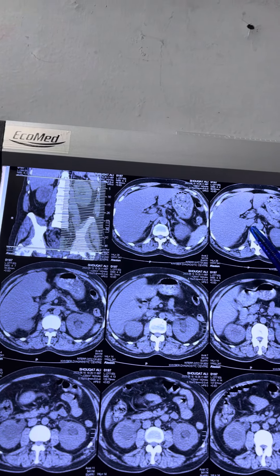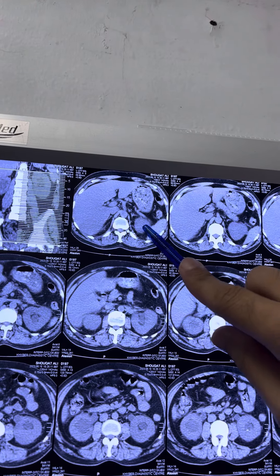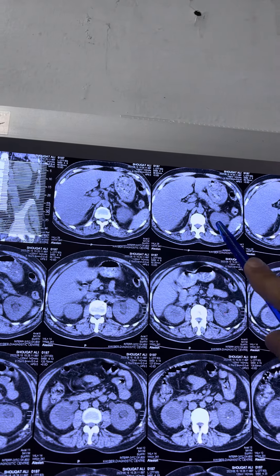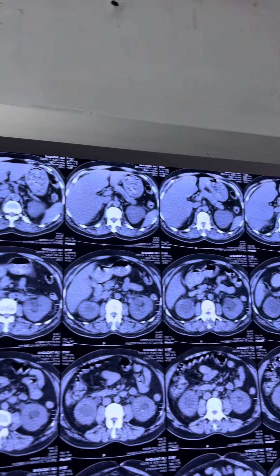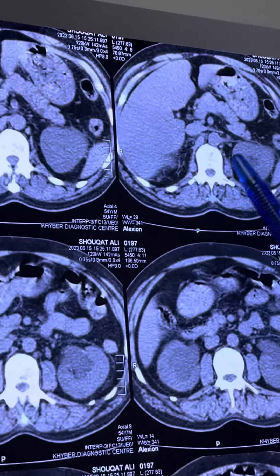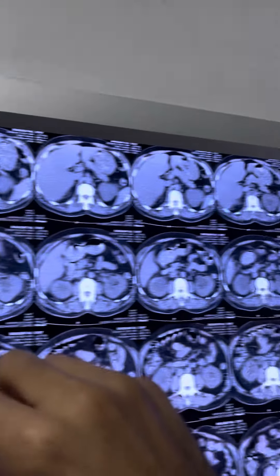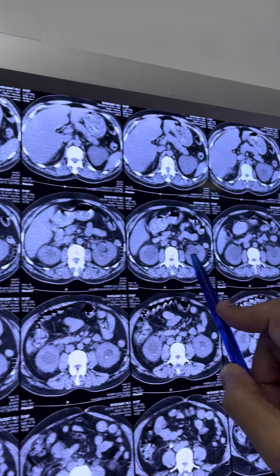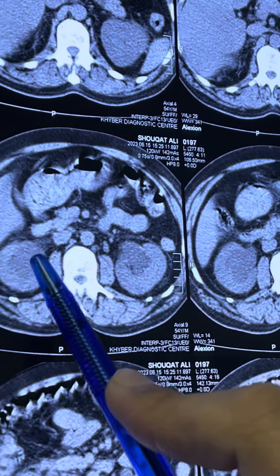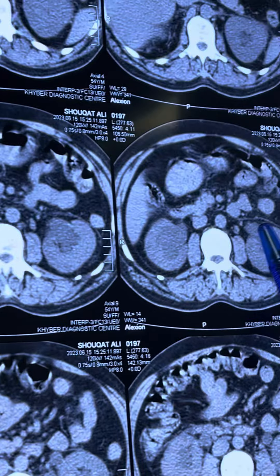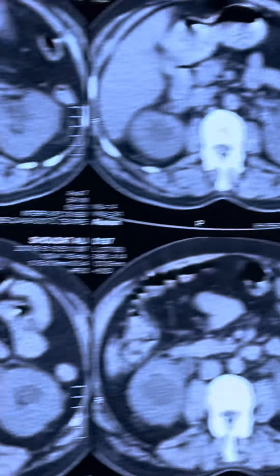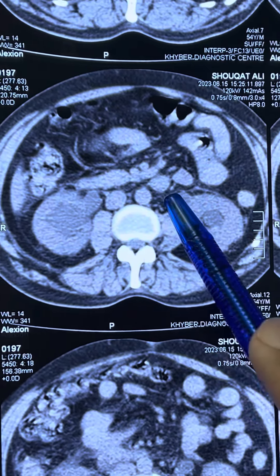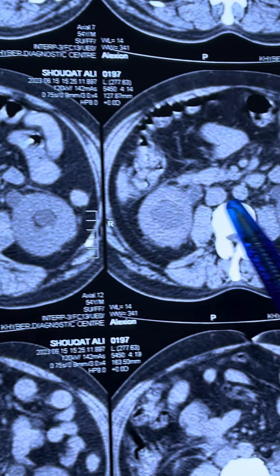Starting from the start, in this film, the left kidney is appearing starting from this slide here. We can go down here — pelvic fullness appears here in this slide. Here the pelvic fullness, proper hydronephrosis on this side and on this side as well, and a small amount of fluid that is extra-inner pelvic. Hydronephrosis on both sides, and these ureters appear in this slide.